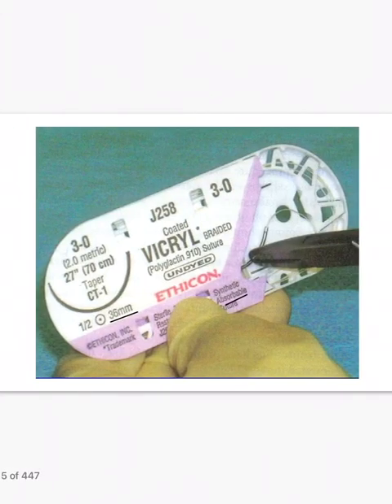So first of all, we'll get started with the suture material. This is a commonly seen suture material in your table viva. If you are smart enough, most of the things are written here. Like this is a Vicryl suture material, made up of polyglactin, and this is braided, meaning it's a multifilament suture, and this is a synthetic absorbable suture.